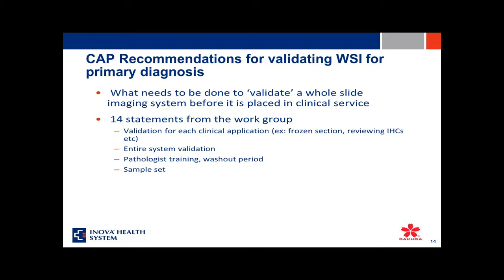And the sample set, there are a number of recommendations on the sample set here. They say the minimum is 25, and some people say it's 100. So again, it depends on your laboratory director. And the most important thing is to measure your intra-pathologist reproducibility rather than your diagnostic accuracy. What that means is you have to evaluate how well your pathologist is able to diagnose from a digital versus manual slide, rather than whether he is diagnosing it correctly or not. That's not important. What's important is how well he is diagnosing a manual slide versus a digital image.